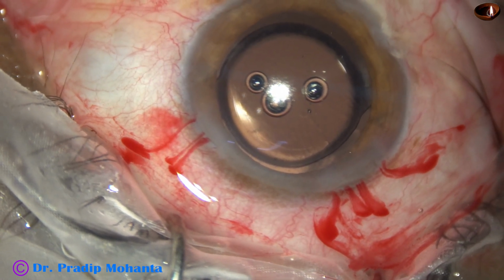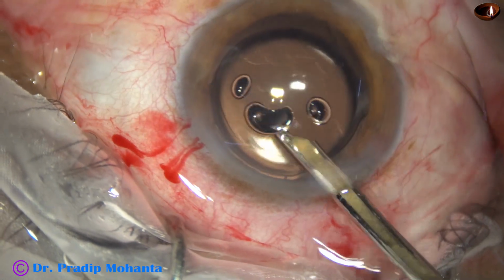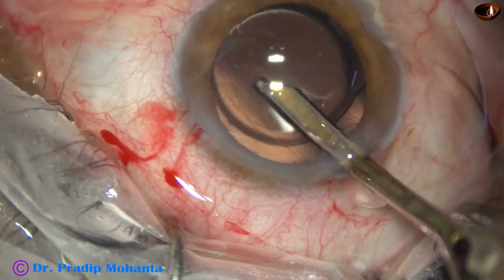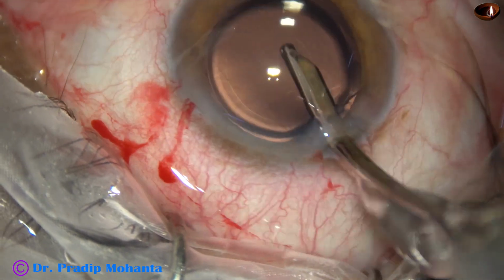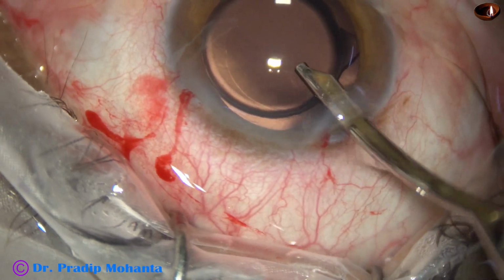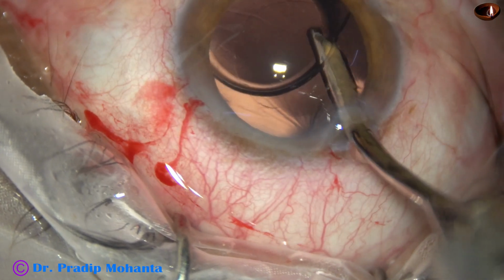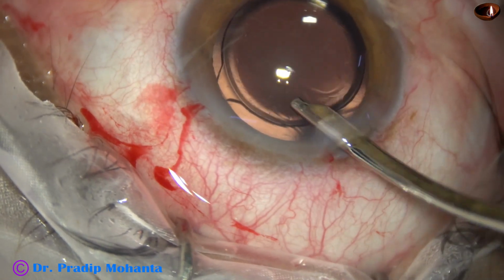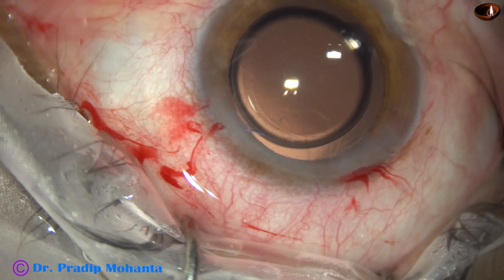And now our job is to clean the visco that is there in the anterior chamber and in the capsular bag. First, irrigation of the anterior chamber, and then irrigation and aspiration for some time, and then I go behind the lens, irrigate and aspirate for some time, and now I am planning to use the bimanual irrigation aspiration.